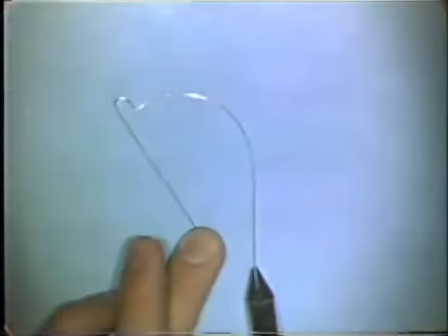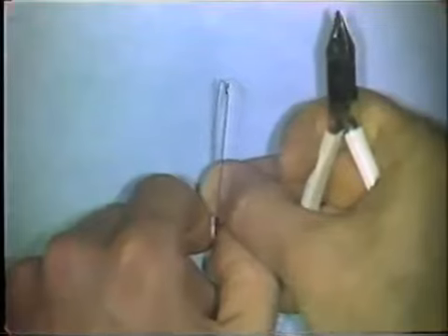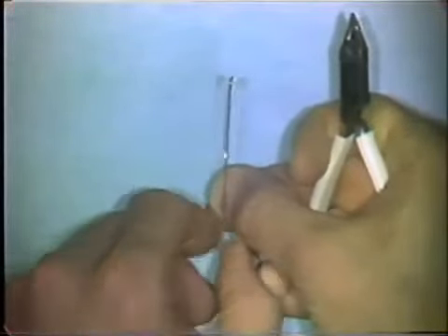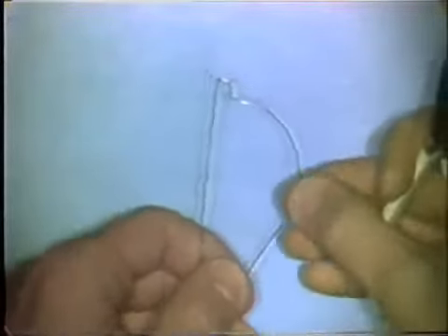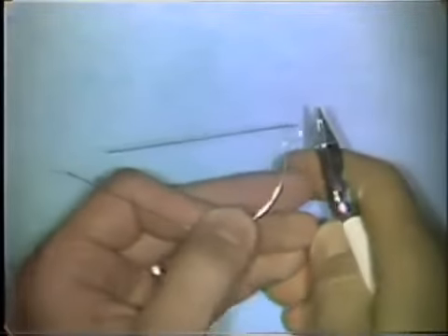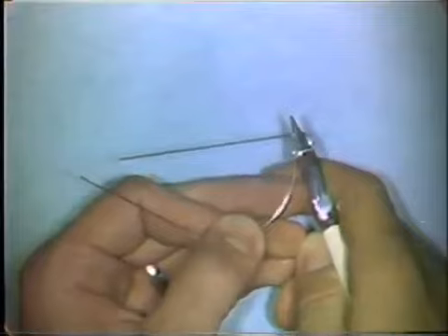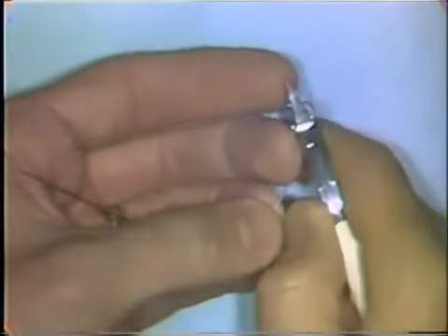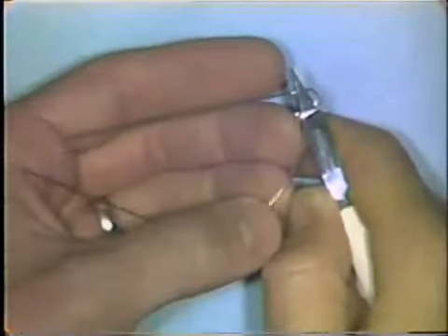You pick the wire up and look at it from the side view and check the plane in space. See which section of the wire is off. In this case, the entire curvature portion has to be bent upward so that the loop will adapt to the table. You place the beaks of the plier over the entire loop and apply an upward pressure on the curvature.